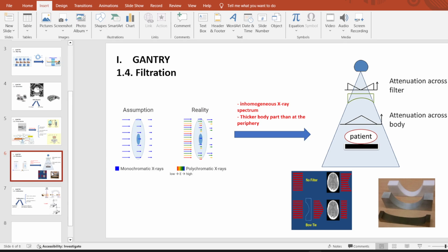So the filter is, how can we say it in general? In general, a filter is a thing we use because after going through the filter, we get a result that we want. That's a filter. The same applies to CT. Filtration in CT works exactly the same. But the point is, we gotta determine what the thing we want is in this case. So the motivation behind using filtration is the demand for monochromatic X-ray.